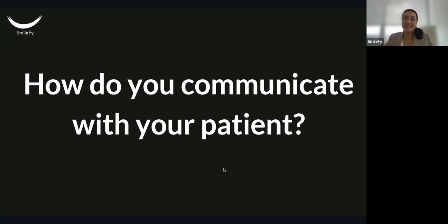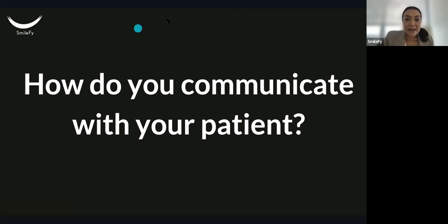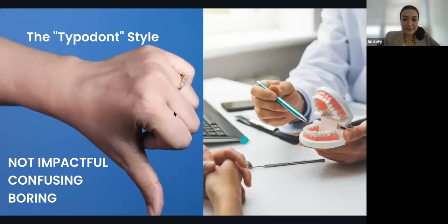Oh, I see you're already voting. I see general, prosto, implantologist, ortho, dental technicians. Oh, wow. Let me tell you in advance, this is very useful. I'm also an implantologist and I worked with prosto for 17 years. I'll show you the transformation about this. So we have general, prosto, implantologist, ortho, and dental technician. This is nice. Thank you so much for answering me so I can guide you through that. So let's start. Let me close the poll. Let's get started.